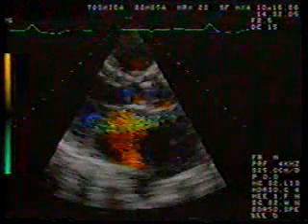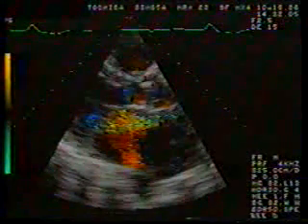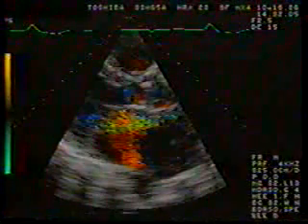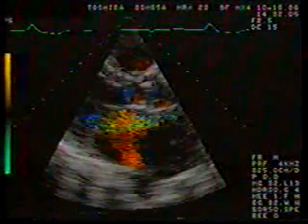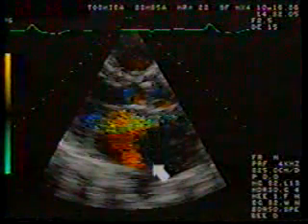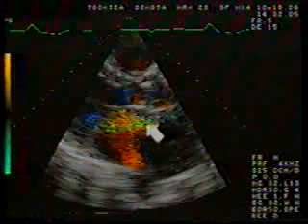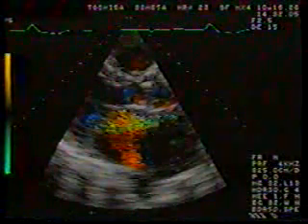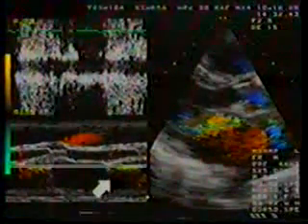The fact that these anteriorly directed signals represent mitral regurgitation can be confirmed by pulsed wave Doppler. Here a Doppler cursor has been positioned so as to cross the left atrium. The pulse sample volume is anterior in the turbulent portion of the jet. The cursor has generated a color M mode: right ventricular outflow tract and aorta, and left atrium.